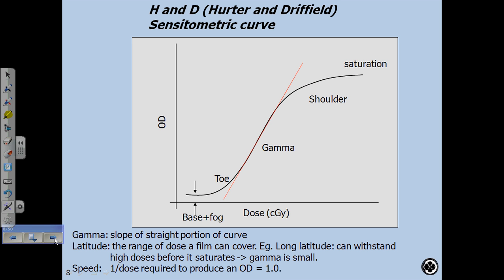So I might want to repeat this for 10 MV, 18 MV, etc., and look at the curves. And as it turns out, what I've seen is that over all the photon energies, the curves look very similar for the films. So I don't find there's much energy dependence, but it's still a good idea to do it on your own when you're going to be in the clinic. In other words, to look at the different energies. So now for this film in the processor, you have a curve that relates optical density to dose.